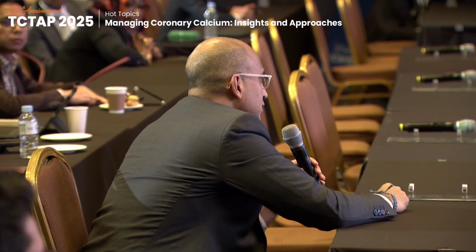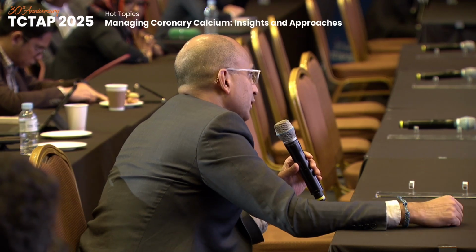We do. Actually, Akiko and I were talking, we have a series of cases where with the IVL, you get opening of the ostium and it looks better. But we don't know if that's going to happen or not. And sometimes, rarely, I guess, it could get worse, especially if there's a flap or something like that. But we need to study more what the orientation was. I think in this particular case, it was a risk-benefit calculation. I could take the atherectomy around the curve, but I would have been more uncomfortable doing that. So that's why I picked it this way. But I think that in general, if it's alongside, it doesn't usually slide behind. I don't know. Anyone else?